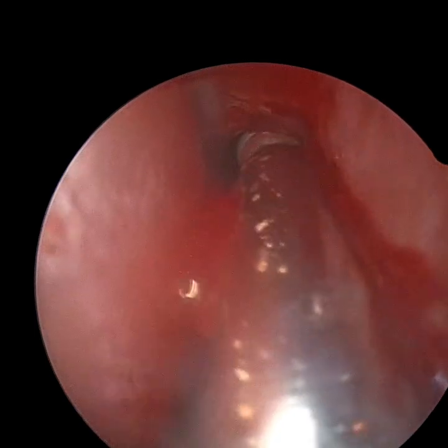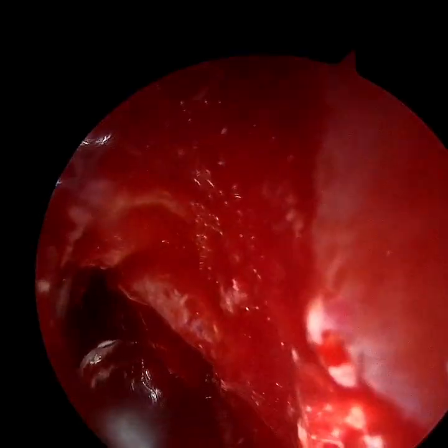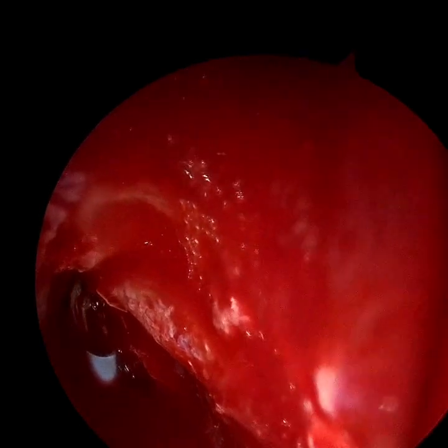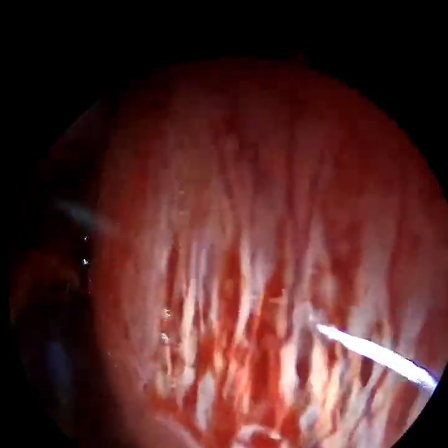So these are drug eluting stents which are there for quite a long time, at least for a couple of weeks, and they keep on releasing the drug in the frontal sinus. So this is inside the frontal sinus on the left side. So here we ejected, and this is on the right side.